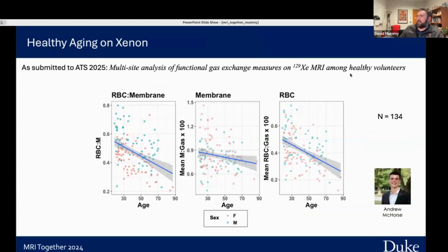And then a grad student of mine here, Andrew McHorse, is working on, coincidentally, almost the same size, but this population is all healthy subjects. And these are metrics I didn't talk about from the spectroscopy specifically. But the main takeaway here is we're doing these curve fits to measure the effects of age and then, behind the scenes, sex and BMI.